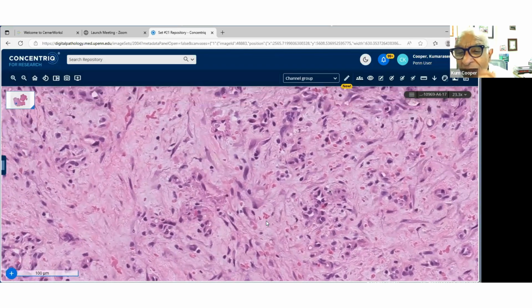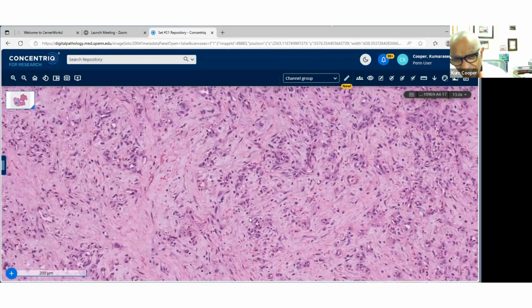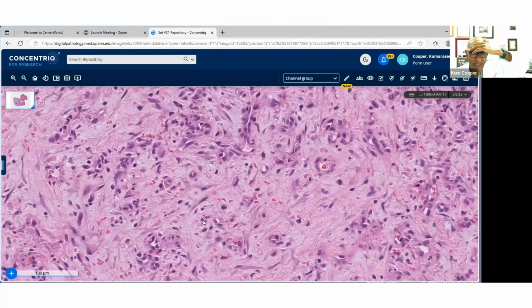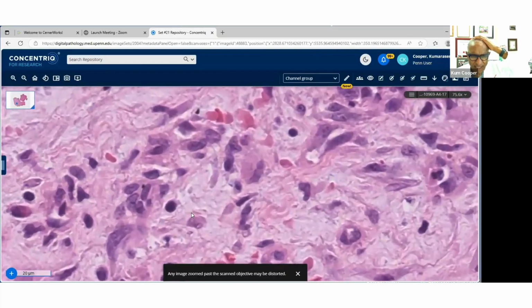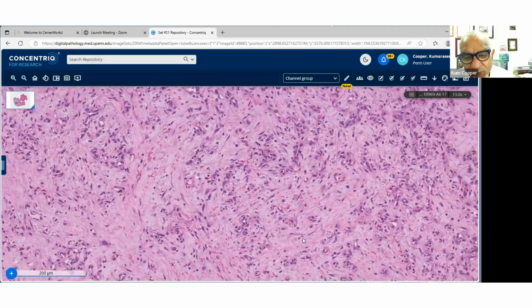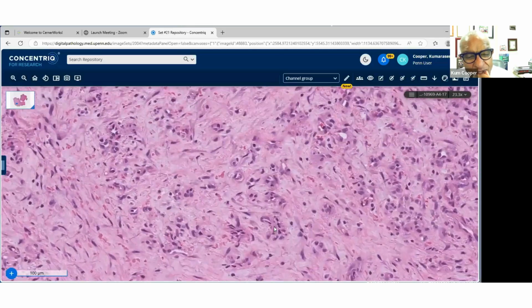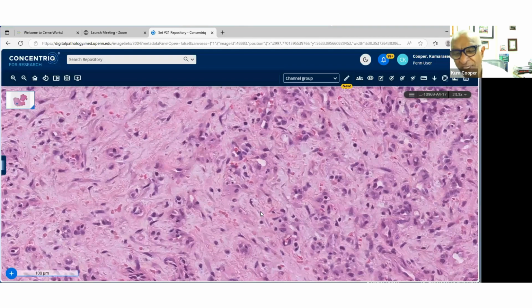And the bacillary angiomatosis, BA as I call it, the ones I've seen have been much, much more epithelioid in the endothelial cells, and also the fibrinous material has little neutrophils with it. Some of these look, but that's a nucleus there, I think. Yeah. So this was just a quiescent one, and I don't know if that's because of the immunosuppression or not, but the follow through was that PCR was positive.